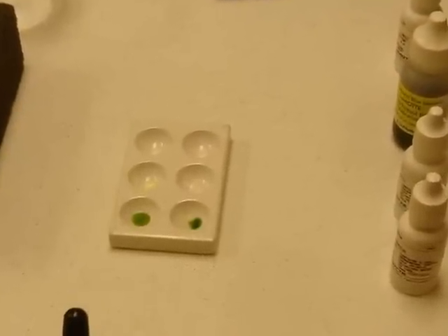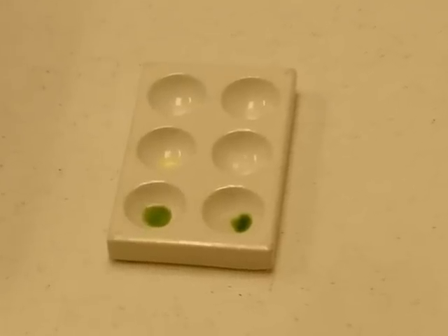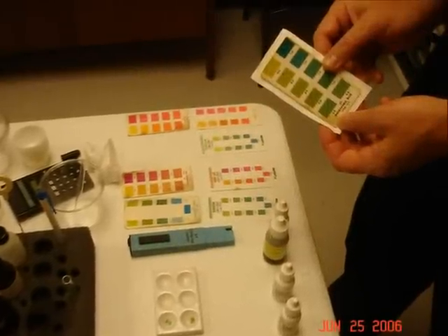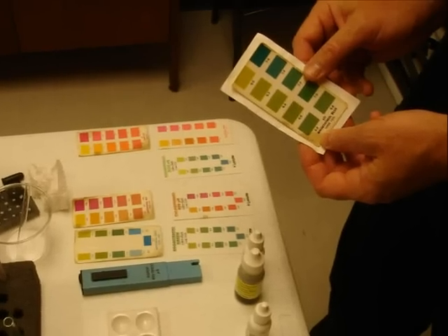The color drops react instantly. For most people, once they're experienced, it's a matter of a few seconds to make their reading. The tough part, if there is a tough part, is to be sure you've got the right card in your hand with the right shading of green, red, blue, whatever.